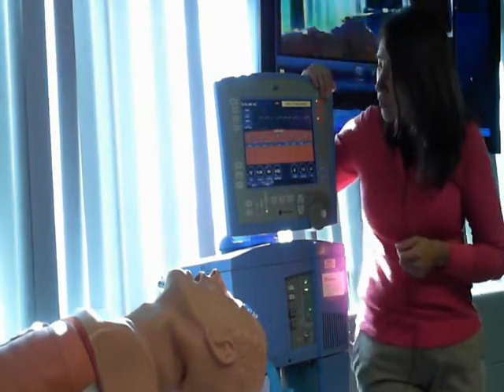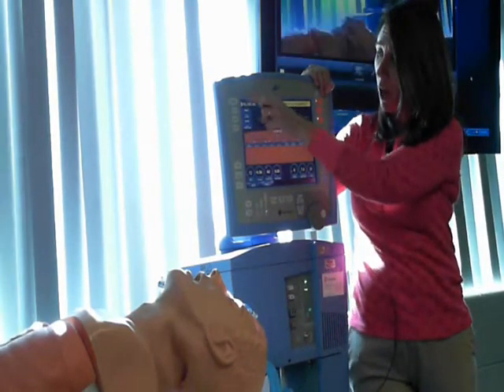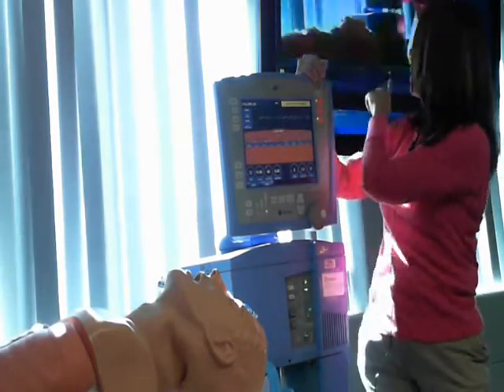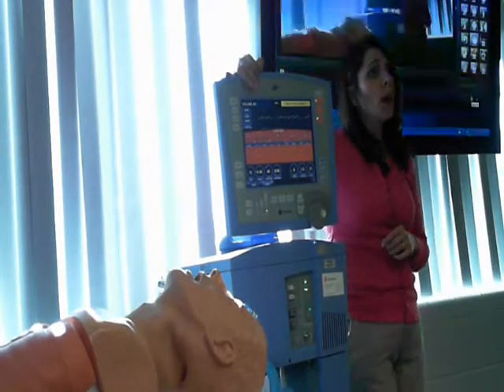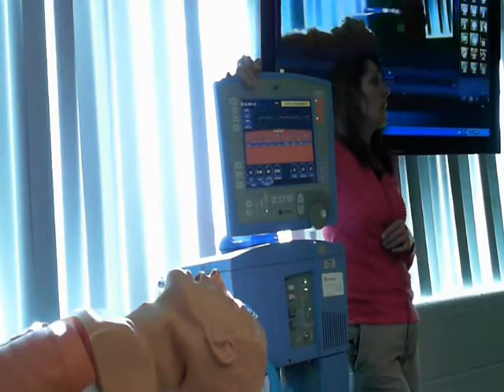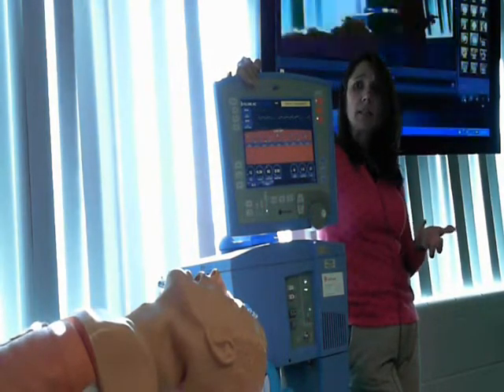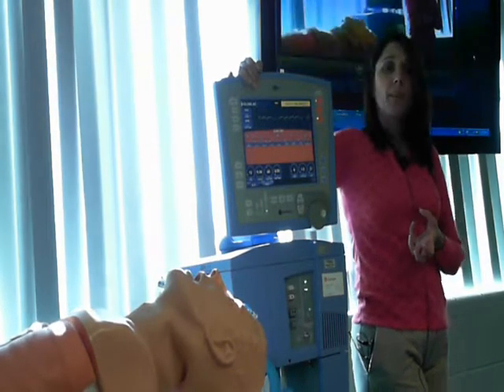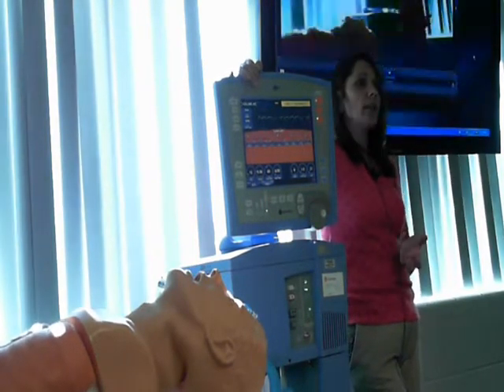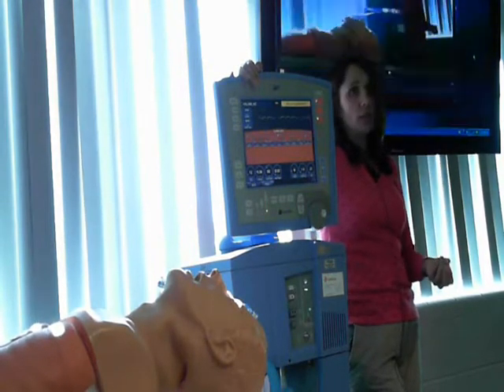Okay? So those are your basic settings, other than if you'll take a look up here at the top of my screen, and I apologize, I'm not sure how well you all can see it, I have something called the mode. The mode means, how are we going to control the breath? Is the machine going to be in complete control? Is the patient going to get to choose when they take a breath? There are modes that are combinations.